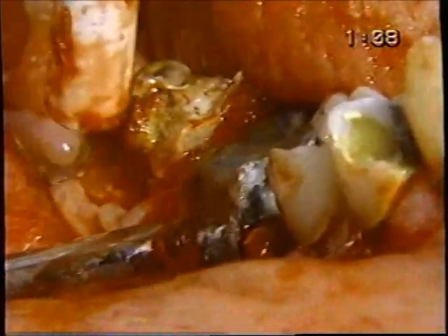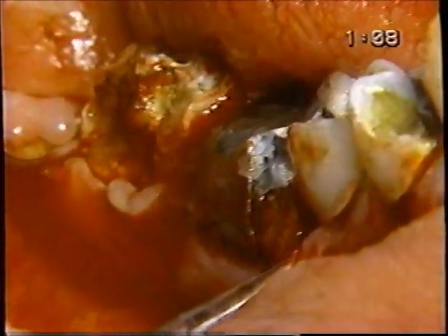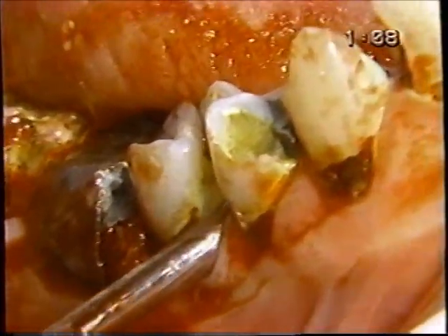Now, I'm going to go back here. This is just too small. It won't engage or do anything. What we're trying to do, again, as we've mentioned before, is to expand bone, to disrupt the ligament, to cause an inflammatory reaction occurring at the base of the root. Okay, this is one that looks like it could just break apart on us. Okay, a lot of pressure here.